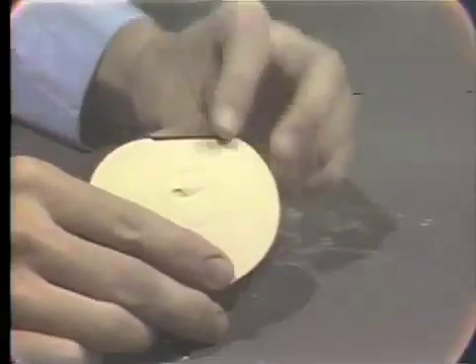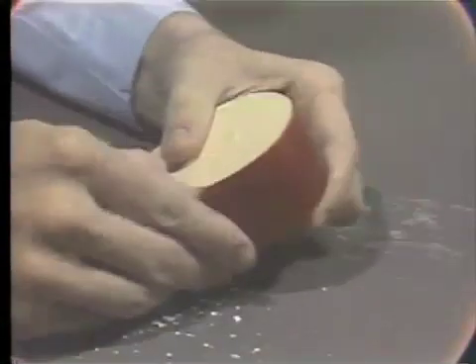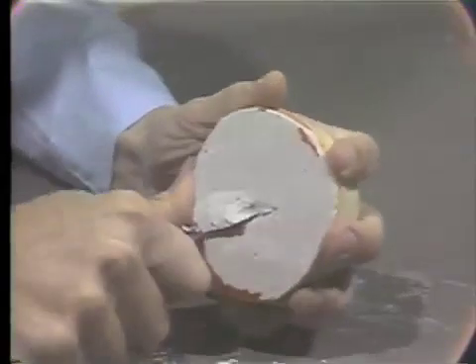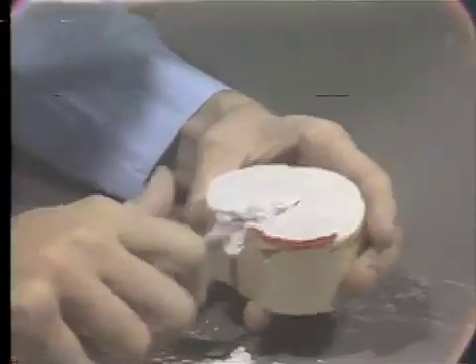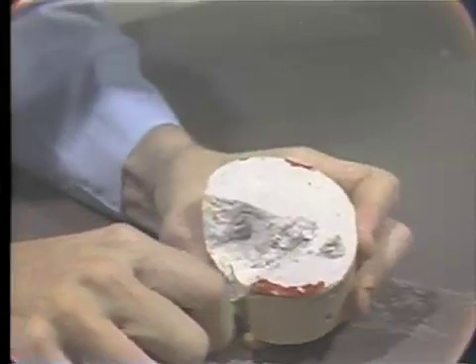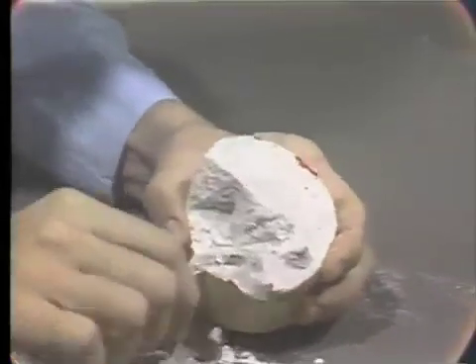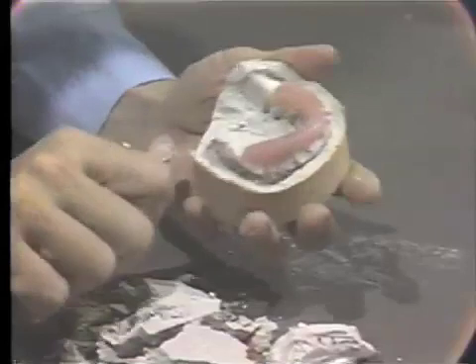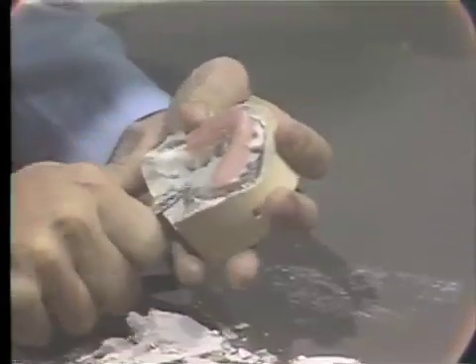Again, the first step is to remove the outer boxing strip, exposing the stone base. You will also see here the impression plaster and pumice mixture. This will separate quite easily by first cutting away some of the impression plaster, then carefully placing the edge of the laboratory knife into this mixture and breaking it away from the mandibular impression. The application of the foil substitute on the impression plaster pumice surface prior to pouring this model facilitates this ease of separation.